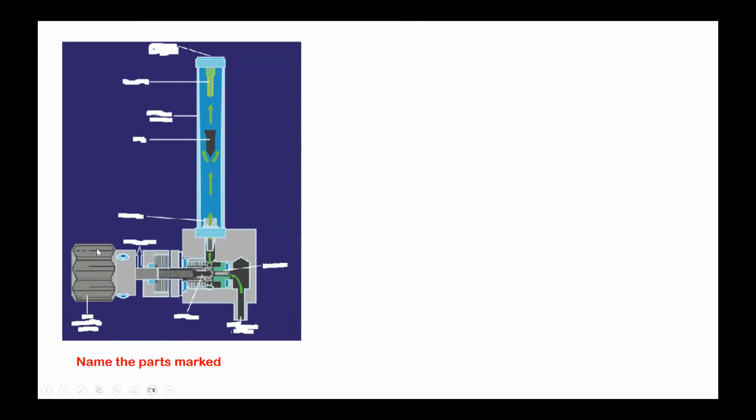This is the control knob that you are using every day to open and close the gases. Okay, so once you operate that, what happens? These are all there is what is called the needle valve. This needle valve will be pushed back and gases will start flowing from here towards the flow meter tube. And what do you think these two are? One here and one there.